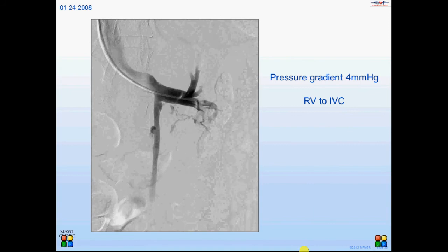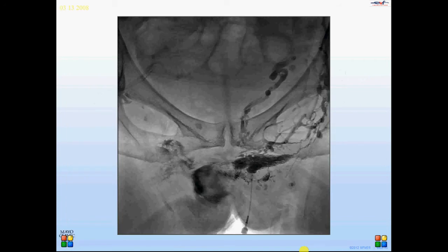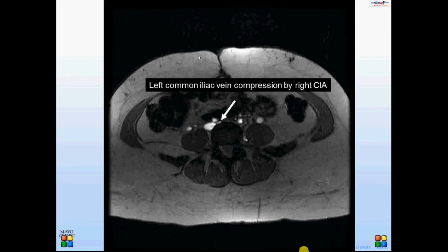And this is confirmed by the venography of the left renal vein. Here it is clear how the catheter venogram can help you, because you can measure pressure gradients, but you also see the reflux into the gonadal vein, which subsequently was treated. And based on the MRI practically and the ultrasound that you subsequently obtained of the perineal area, direct sclerotherapy is applied.